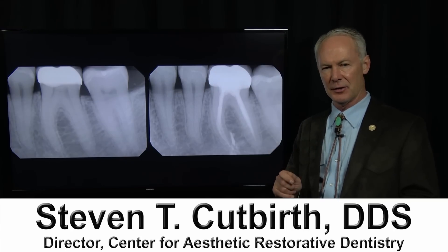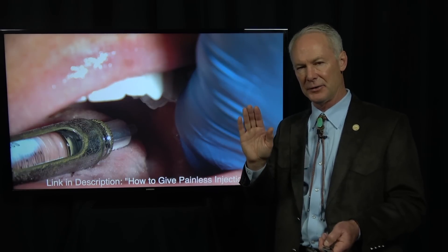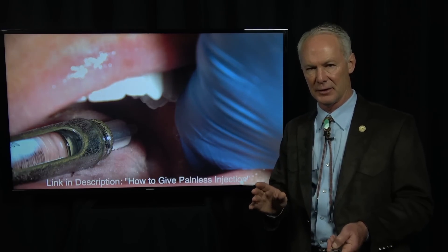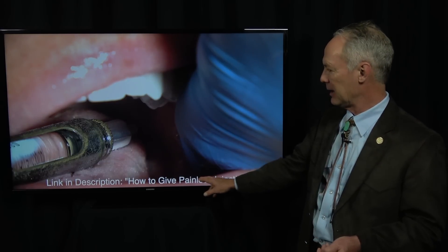Endodontics through a molar crown — local anesthesia. Remember, if you're performing endodontics, always give a block or infiltration and an intraligamental injection. Always give an intraligamental injection, and go to the link on how to give a painless injection.